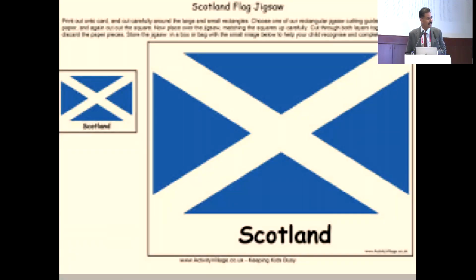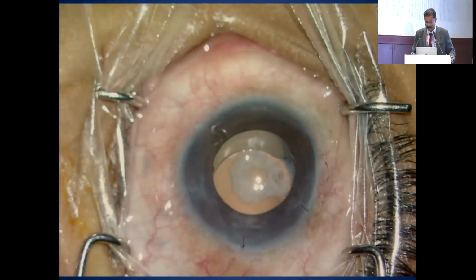That's a new flag sign which I have found in this kind of cases. Amit, you know this kind of flag, new flag? Yeah, this is a Scotland flag sign, so I'm going to publish this anyway. So there are different types of flag signs which can be caused.